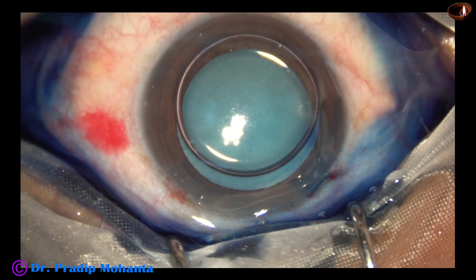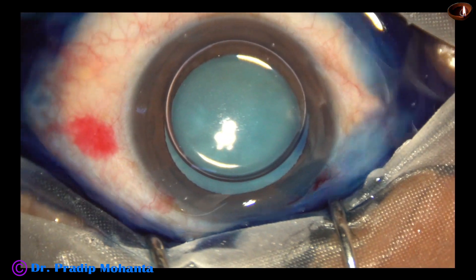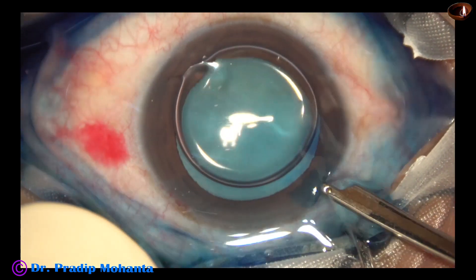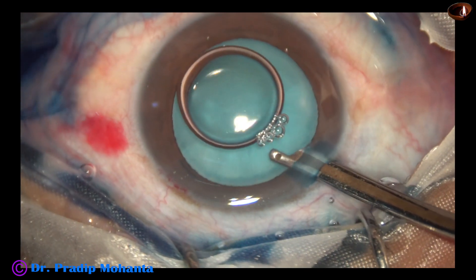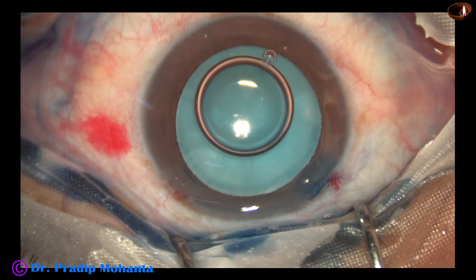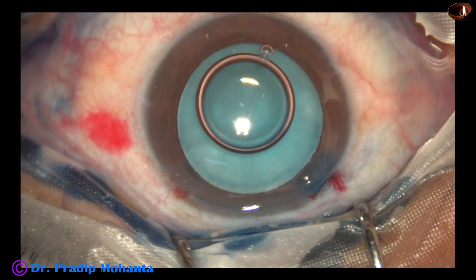Adrenaline is used to maintain the dilatation of the pupil. The dye is washed out using BSS. If we wash the dye out, there is uniform staining all around.